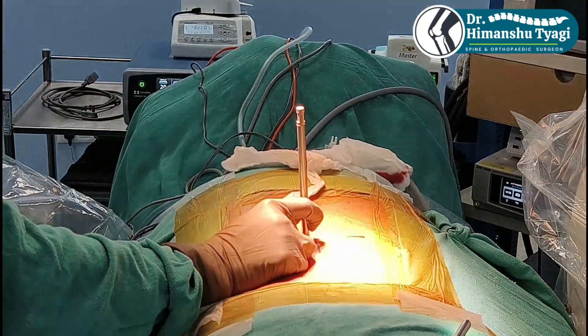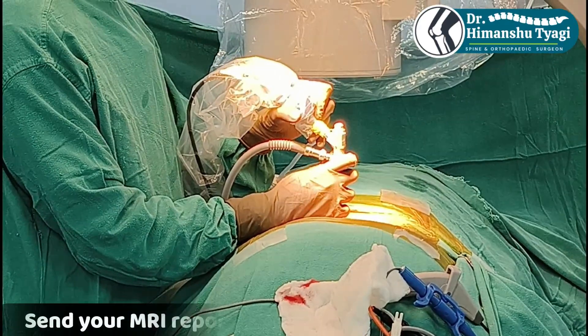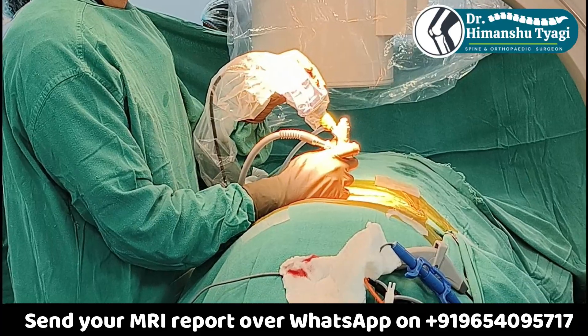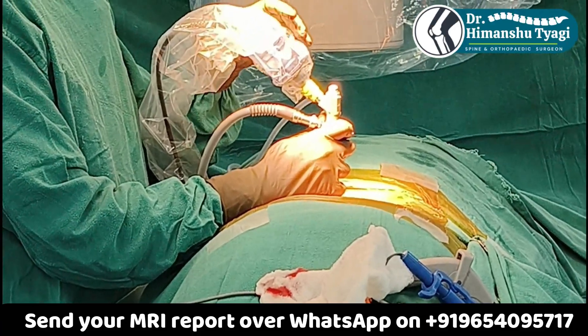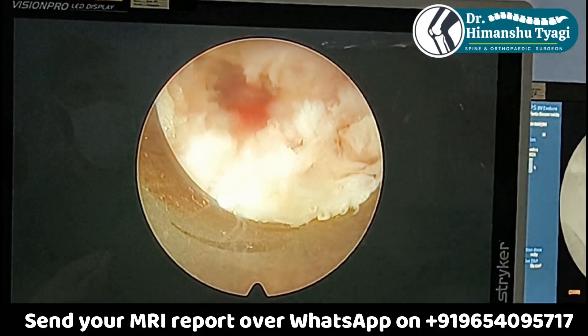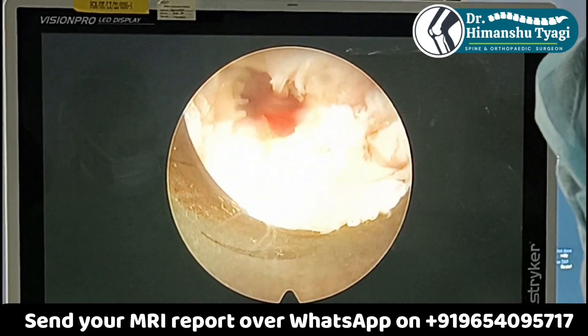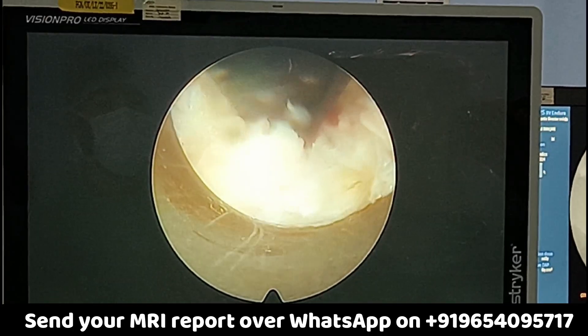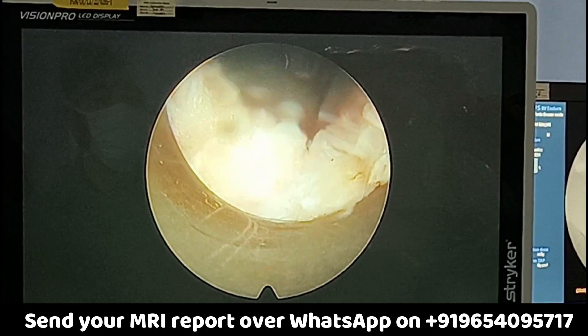The endoscope is basically a scope which projects a bigger image on the TV screen. Throughout the surgery we keep monitoring everything on a TV screen.